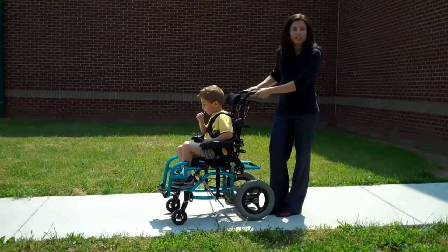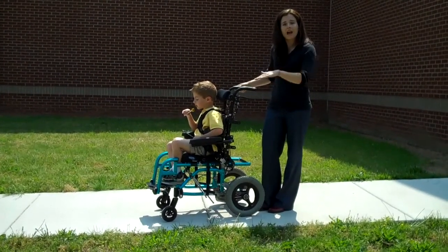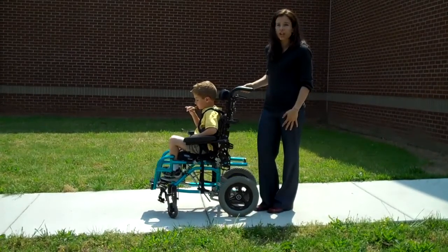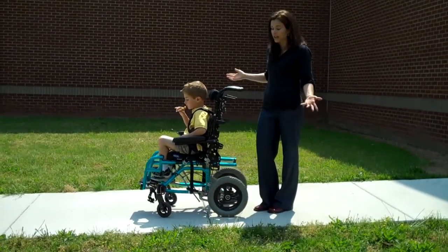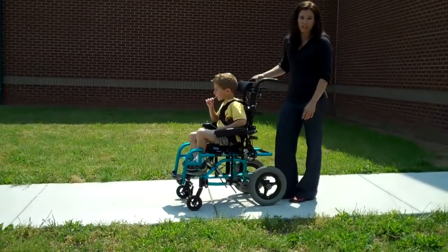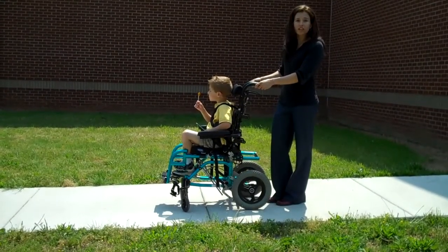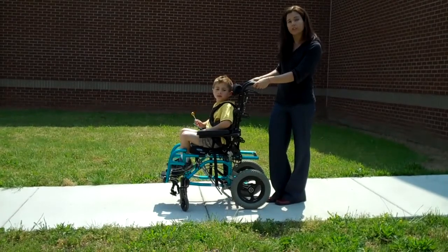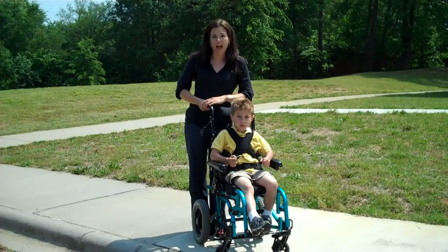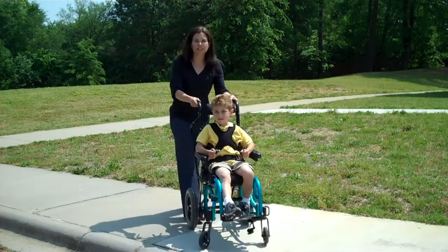Another thing that you want to take into consideration when pushing a child outside is not stopping on an incline. If you mistakenly took your hands off of the child's wheelchair while they were parked on an incline, they would start rolling. This could end up in a very disastrous situation. So always make sure that the wheel locks are secured and you have both hands on the wheelchair at all times outside. Anytime that you are outside, and near a curb or stairs, you want to make sure that the wheelchair is positioned away from it.